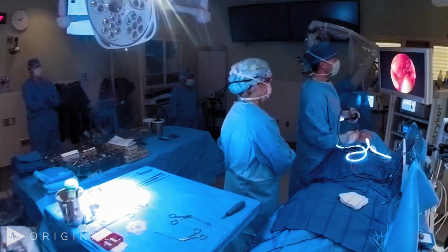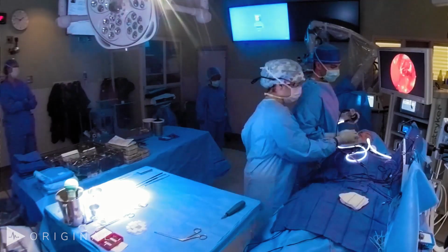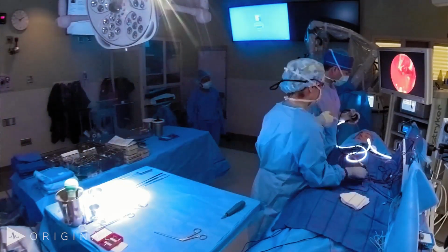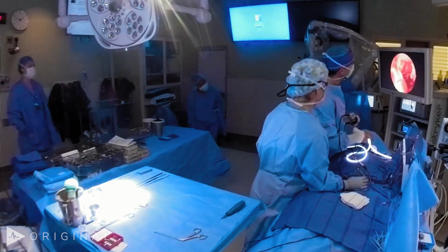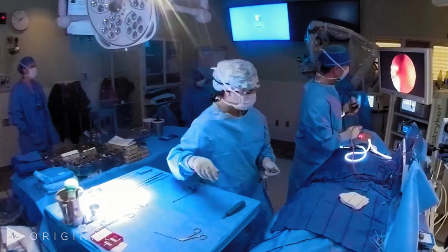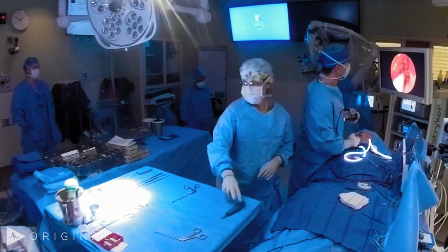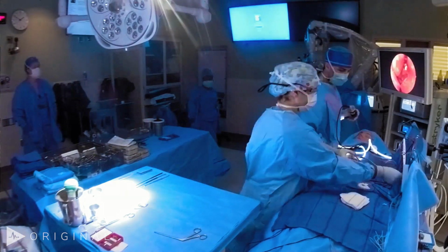The neurologic surgery team has finished their portion of the procedure, and the ear, nose, and throat team has come back in to close. I'm going to remove a small bone chip which can generate crusting during healing. Remove blood products from the sphenoid sinus and place a little bit more gel foam over the defect. This is packed loosely in the sphenoid sinus. We then locate the nasoseptal flap that was raised at the beginning of the procedure and do our best to cover any exposed bone of the septum.